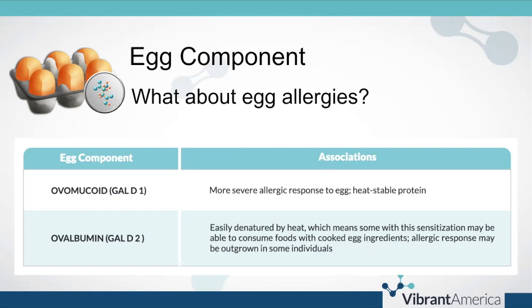If you have run an egg zoomer on a patient that is suspected of having egg sensitivity and it's not very reactive, but the patient has somewhat severe reactions to eggs, or especially if there's also egg allergies in the family, consider running an egg component test just to detect and find out if potentially you're looking at IgE reactions, which of course are not going to show up on an egg zoomer.